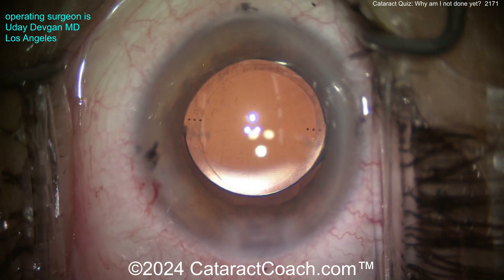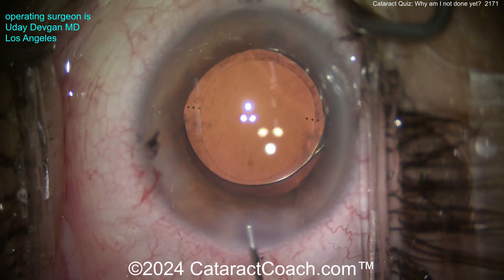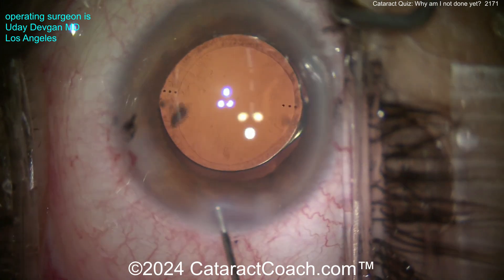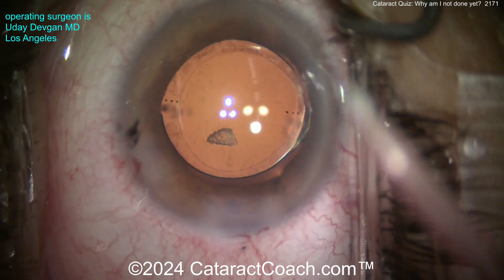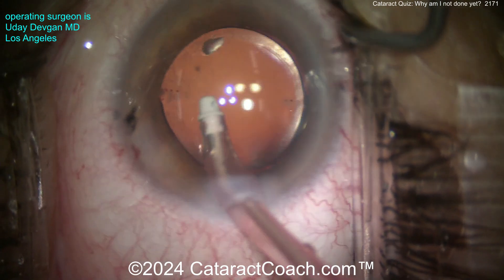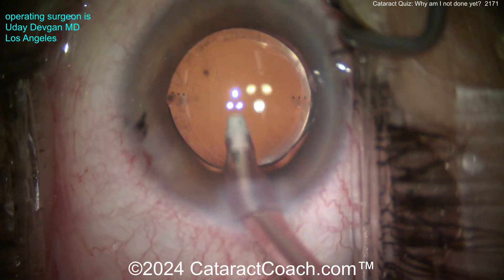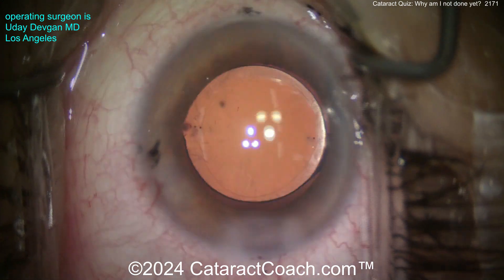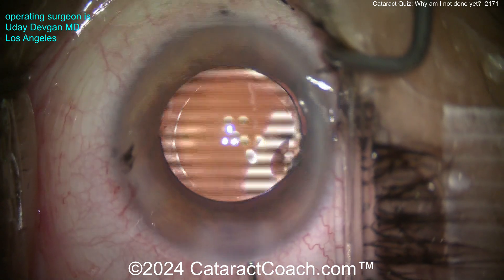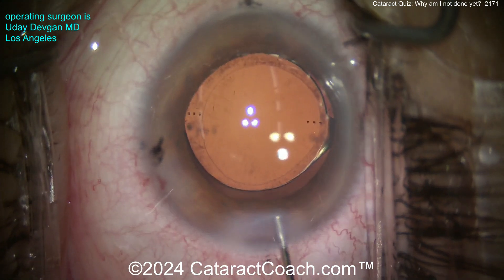You think you're done with the case, right? Seal up the incision and a little bit of BSS — look, there's another piece. We like to do the angle sweep, injecting BSS toward the angle to make sure there's no viscoelastic trapped there and also to make sure there are no little nuclear pieces. There were two little cataract pieces here.